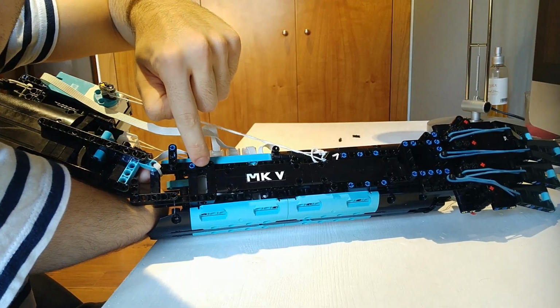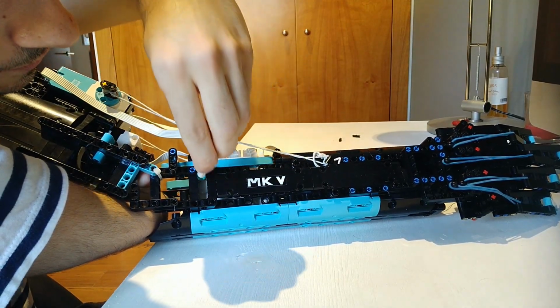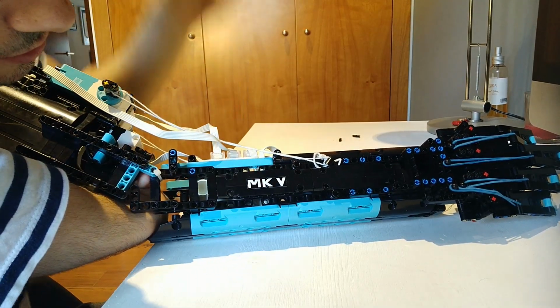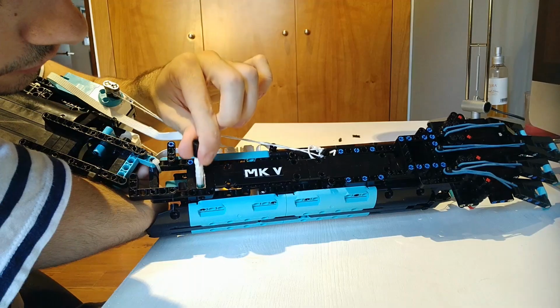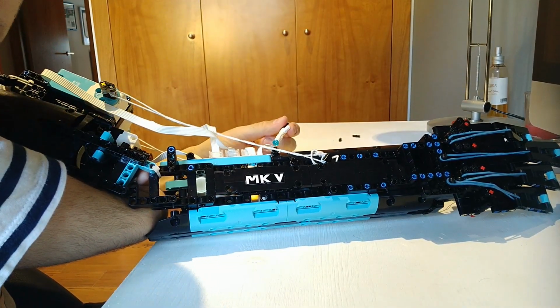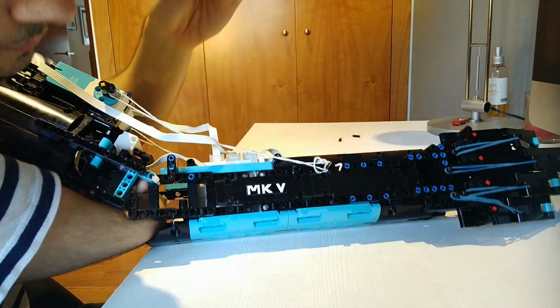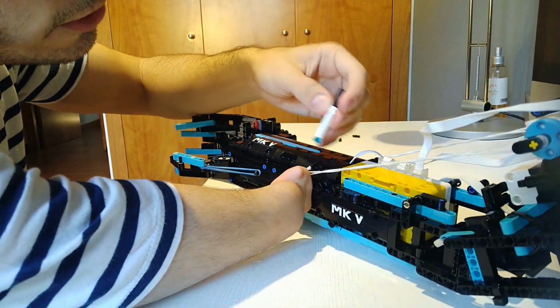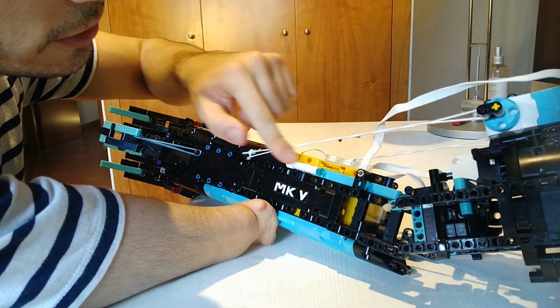So you can see here, there's the hub interior, that's the on and off button, and you pull this thing inside for a few seconds, and you can actually move on the different programs inside the hub just by pulling a little bit to the left or to the right. And to turn it off, it's the exact same thing. And once you're done, you connect this where it's supposed to go, and you actually have the on and off button right here.